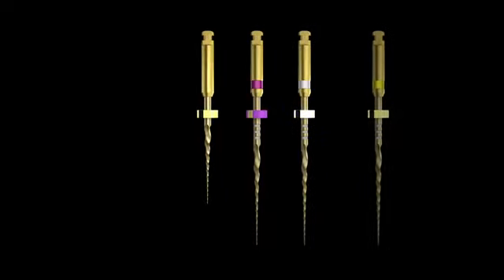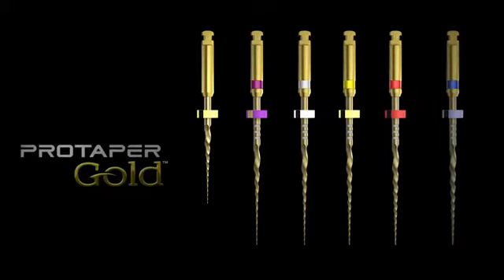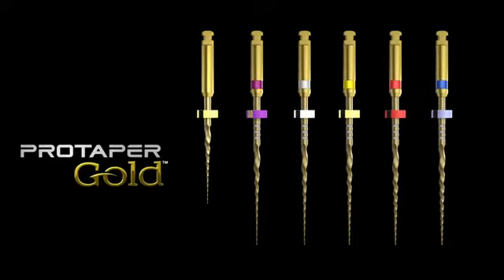So meet our new best friends. ProTaper Gold is exactly the same as ProTaper Universal with these exceptions. They are made of an advanced metallurgy which allows them to be more flexible and more resistant to cyclic fatigue. They literally want to crawl around glide paths. The handles are also shorter for increased visibility.